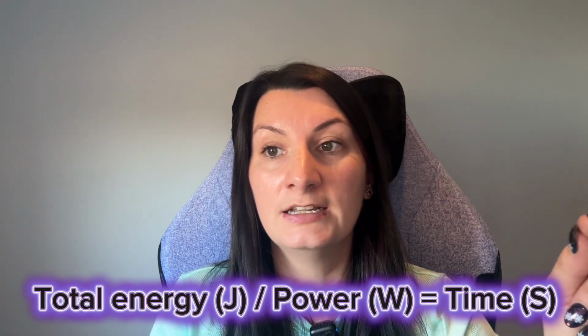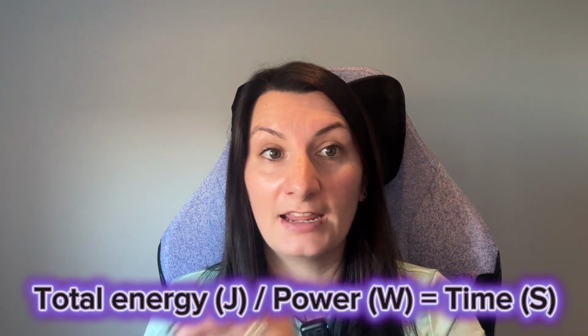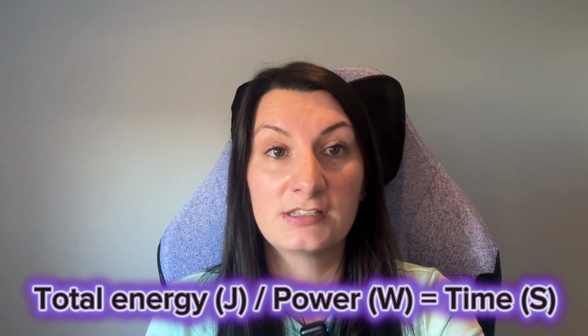Now, next we need to work out the power. Again, obviously this will be based on the power of the device that you have. The total energy in joules can be delivered in all sorts of different ways. Higher power generally is used for deep tissue conditions on large patients. Low power is for superficial conditions and smaller patients. So our total energy in joules, that 5,250 joules we just calculated, divided by the power that you want to use in watts, equals the time in seconds that it's going to take to deliver that dose.